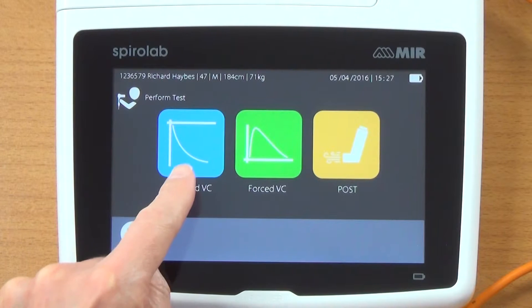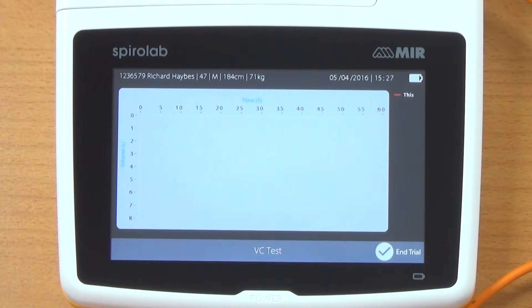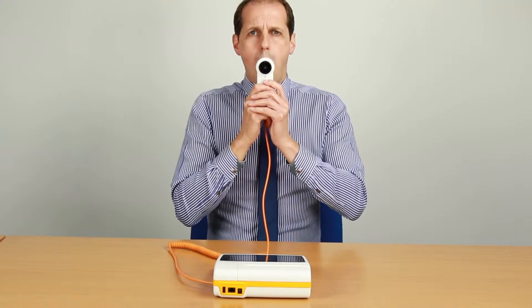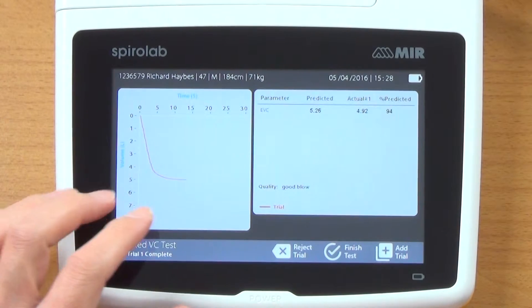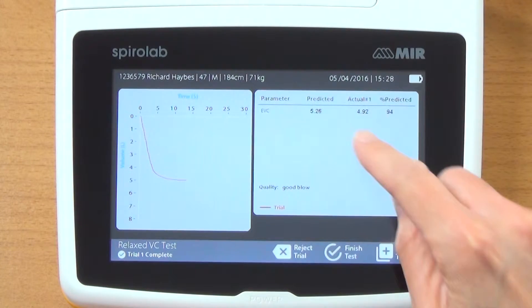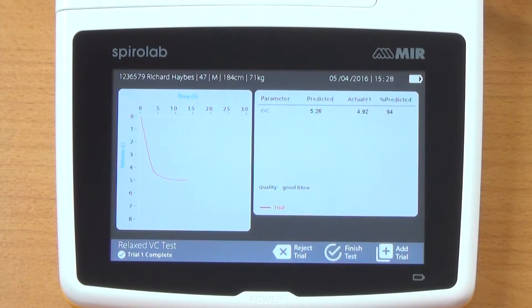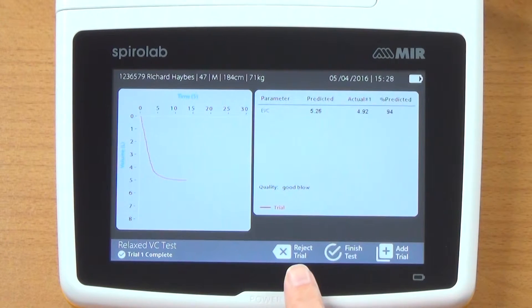On the screen we've got the option to do the relaxed VC, the forced VC, or a post-test. I'm going to click on the relaxed VC. It's now asking me to do my test — this is a relaxed vital capacity. You can see the graph comes up on the screen, nice and smooth and free from second breaths. Over here we get EVC — expiratory vital capacity — predicted, actual, and percent predicted. We also get the quality of the test, and the red one indicates my current trial, which you could reject if you wanted to.